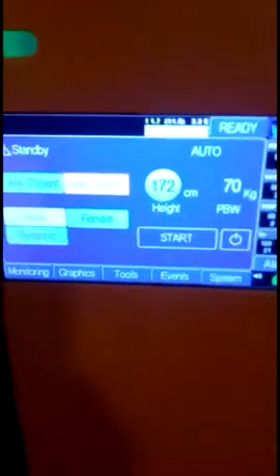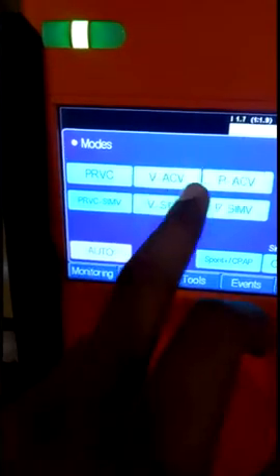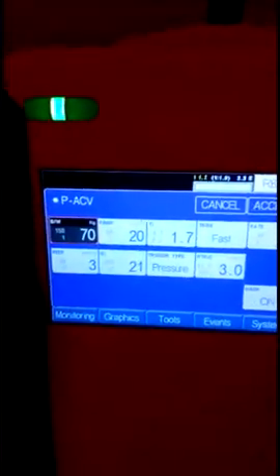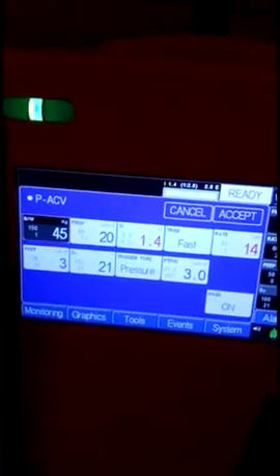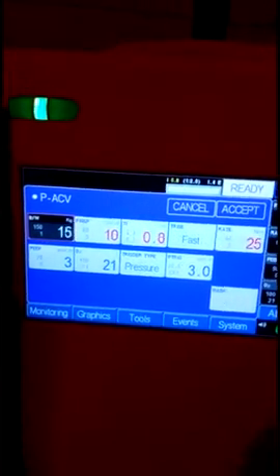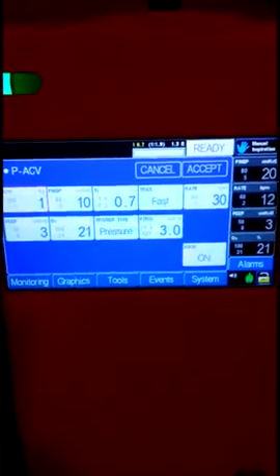Another feature of the 1700 ventilator is that in Pressure Assist Control Ventilation mode, you can easily ventilate neonates as well. As you can see here with the body weight function, I can set it down to 1 kg, so you can ventilate a 1 kg patient with this ventilator.